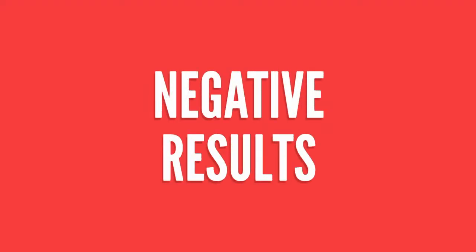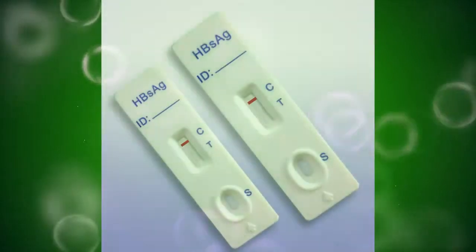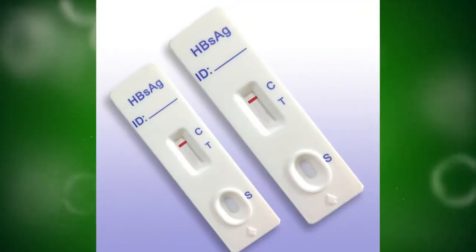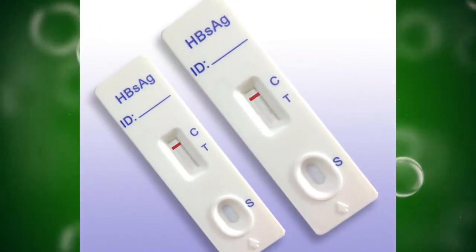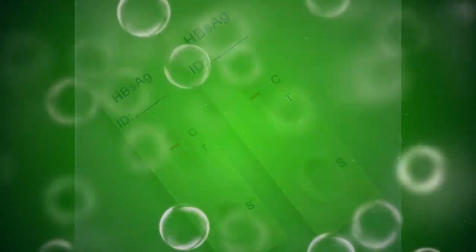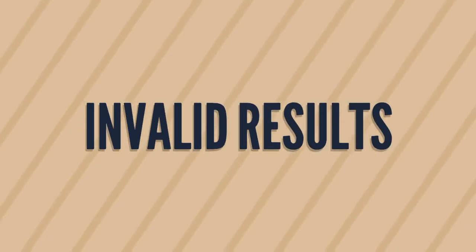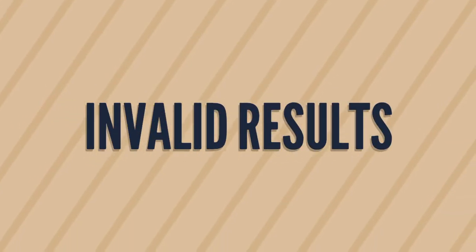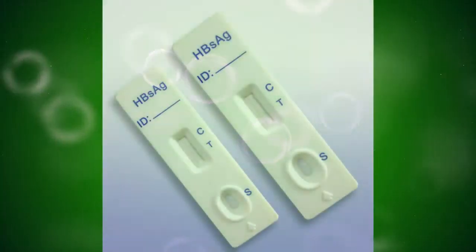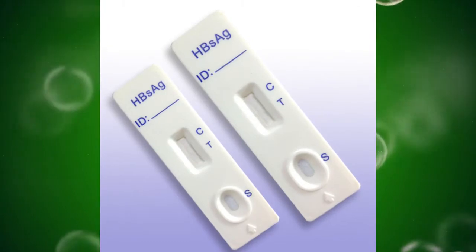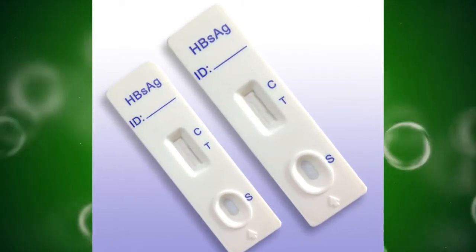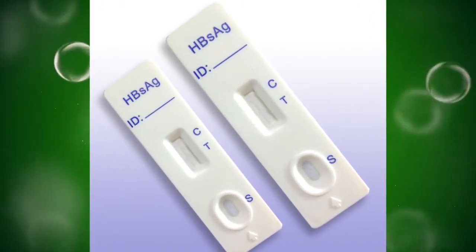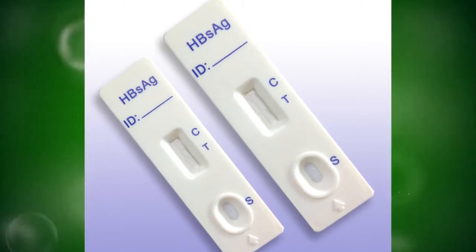Negative results: if we can see only the control line on the cassette, it means the test is negative. Invalid results: if we cannot see both the control line and the test line, it means the cassette is not working well, so we have to repeat the test.